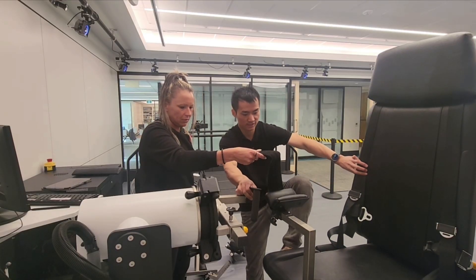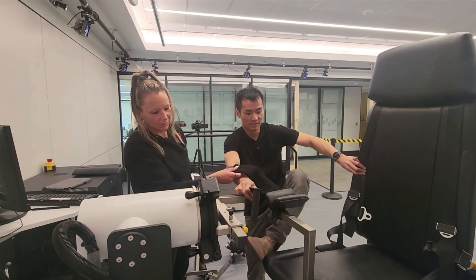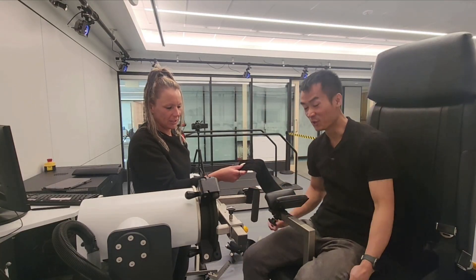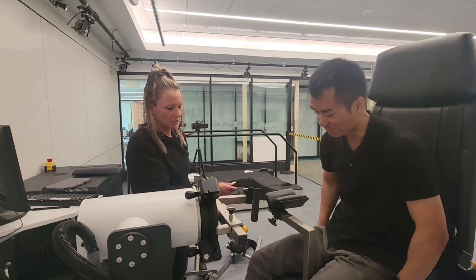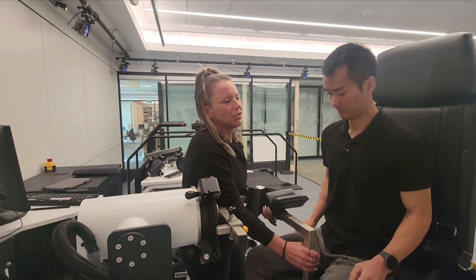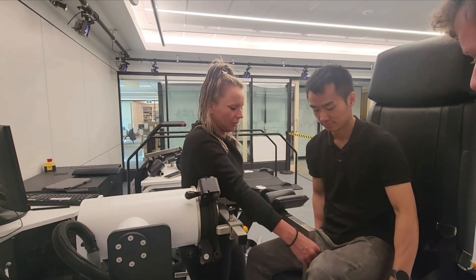So you slide in. The easier way is to let them sit on the chair and then slide this in.